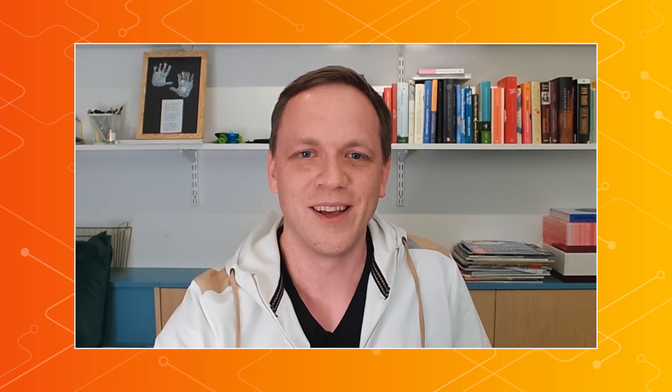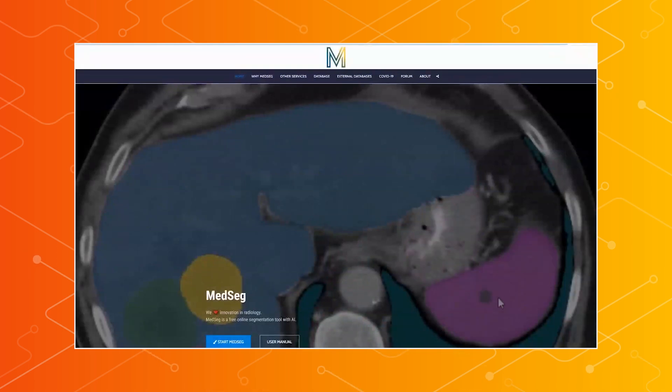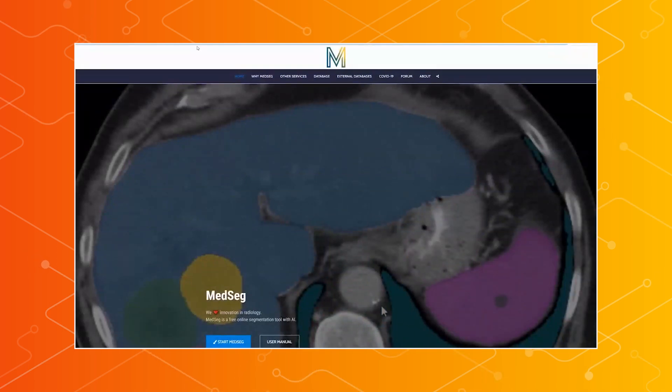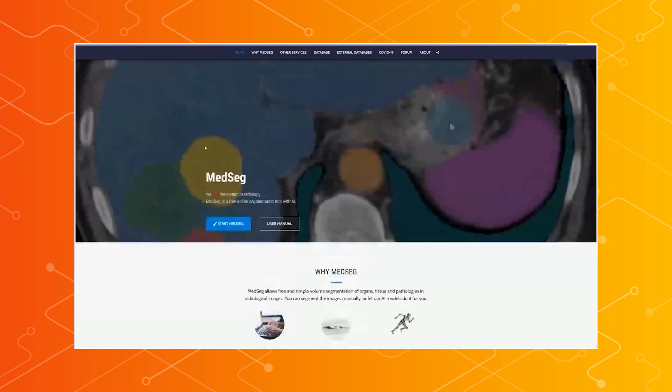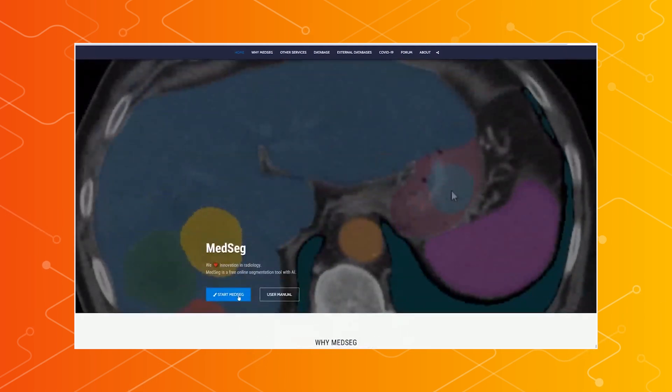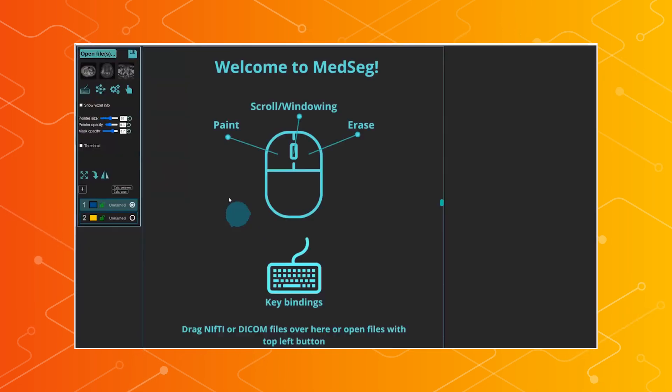That sounds really interesting. I'd really love to see it in action. Do you have a demo that we could check out? I would love to show you. So I will go ahead and try to do a live demo. I'll go here into medsig.ai, which is the homepage, and I start MedSeg.